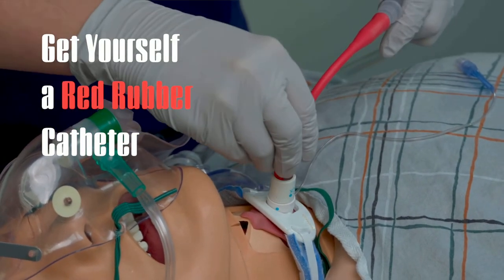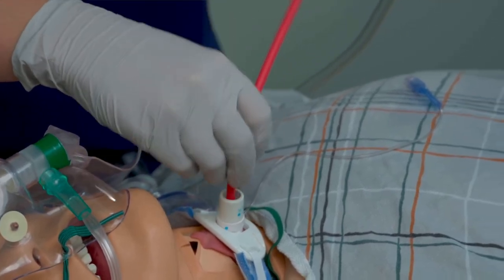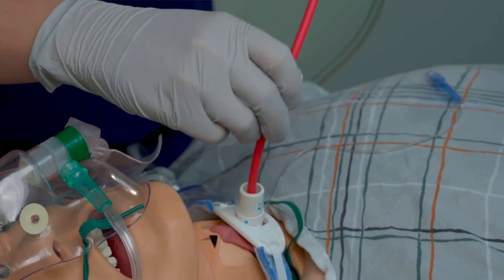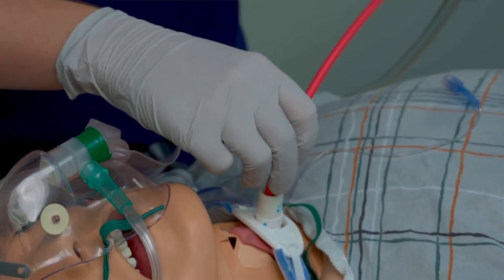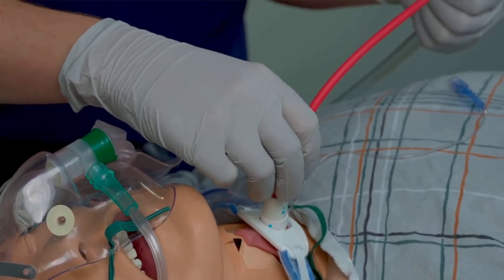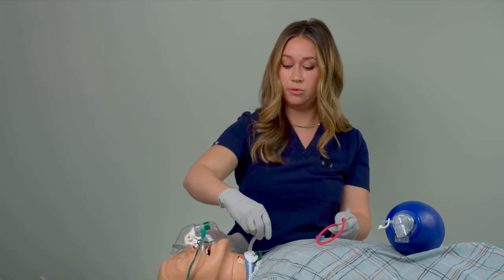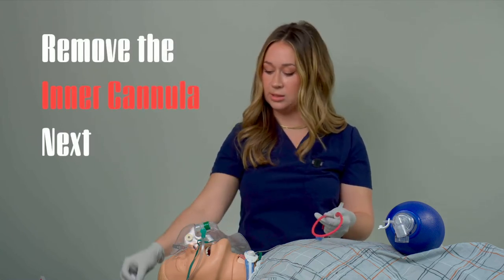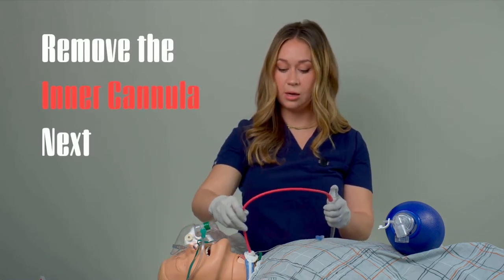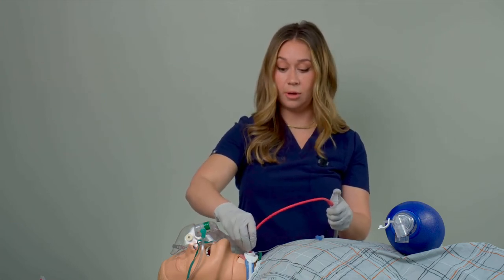As you do this, you want to note whether or not it's easy to pass the red rubber suction. If you can only pass it to a certain point and then you're meeting a lot of resistance, that tells you that there's probably some obstruction. At this point you also want to try to just remove the inner cannula — you might see that it's completely obstructed with gunk — and now you can try suctioning again and note whether or not it's easy to pass the red rubber.